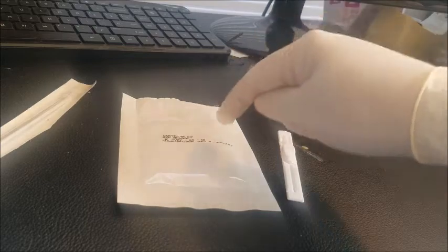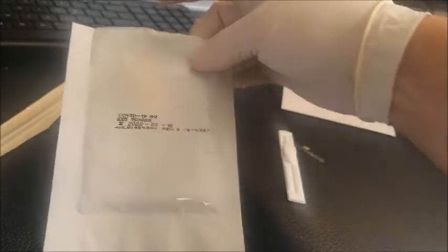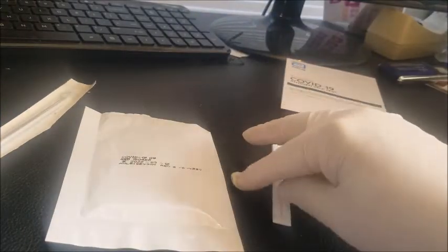In the package, we have the test card that's inside the pouch. If you notice, it'll actually have the expiration date. This one is 3-16-22 when it expires, which is only two months from now, so they don't last forever. And then you've got the dropper bottle, which is right here, and then you have this swab.